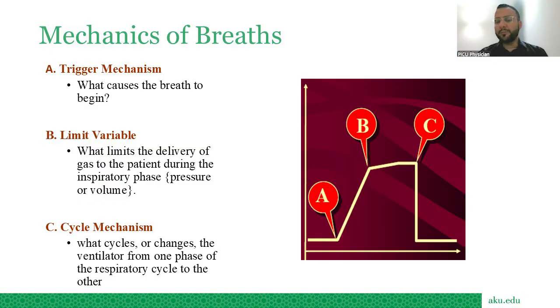For a breath, there must be a trigger, number one. By trigger I mean there should be somebody who starts the breath. Either it can be the patient or it can be the machine. So either the machine will start the breath or the patient will start the breath.